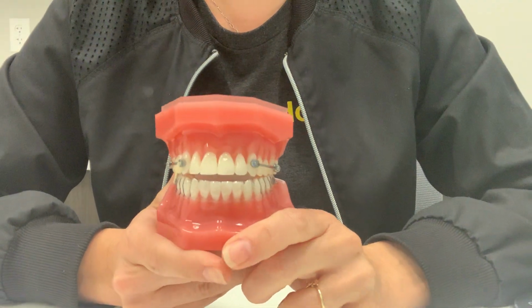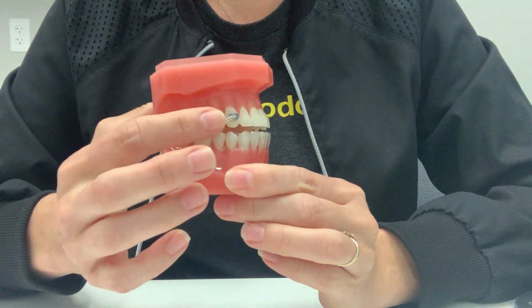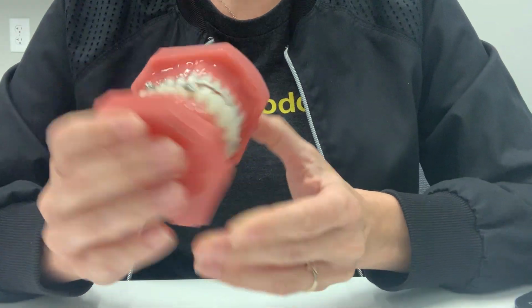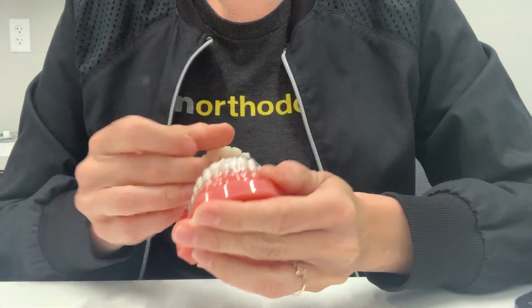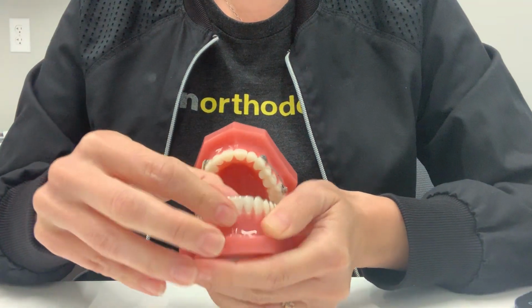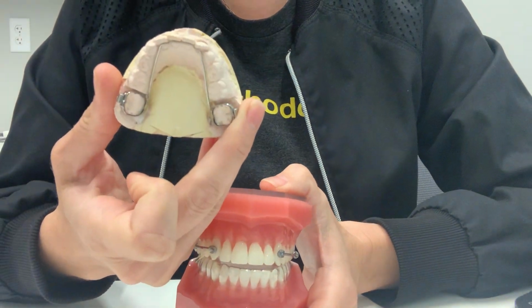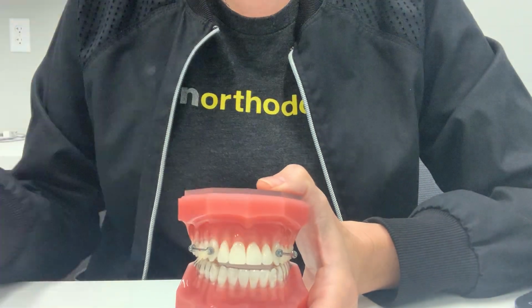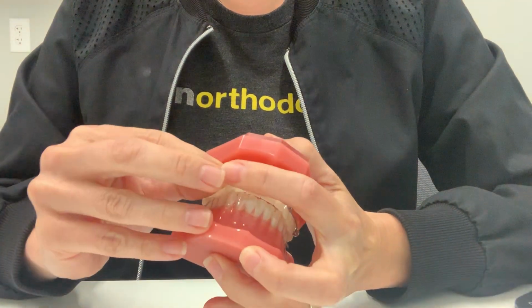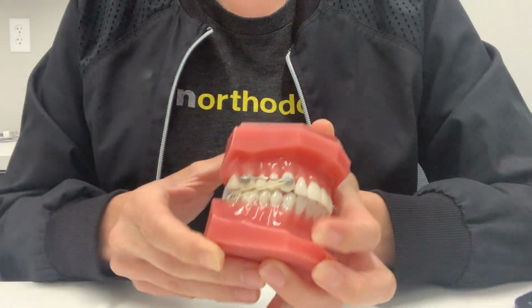We are going to review the instructions for your new motion appliance. It can be either on the upper or on the lower. You can have a clear Essex retainer, which is removable, or you could have a lingual arch appliance that is cemented to the teeth and not removable. You will wear a rubber band that hooks from the appliance to another hook in the back on the opposite arch.